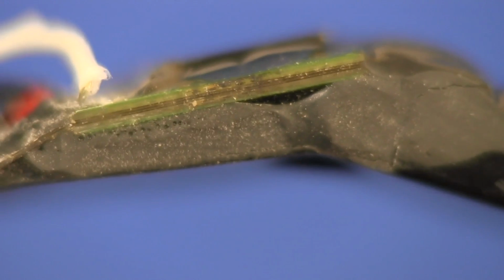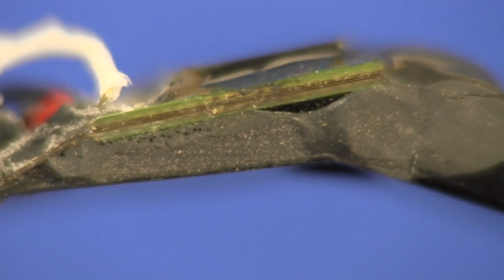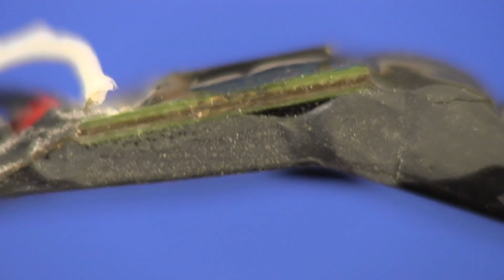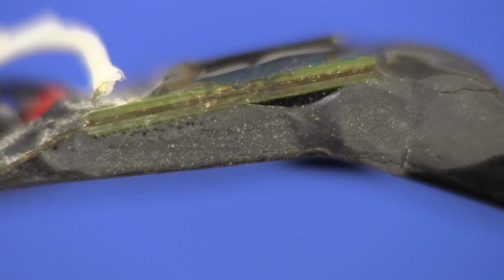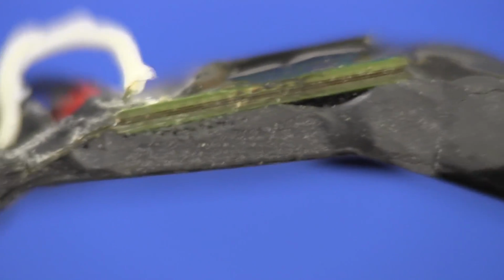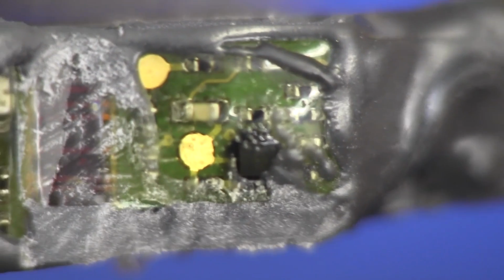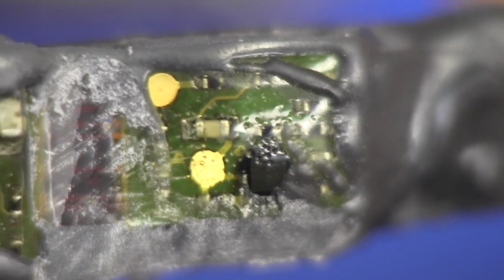It's a very common technique when you need to put something around a circular enclosure like this. I've done this before on seismic products, where circuit boards have to be wrapped around a central core in the middle, like a central wire bundle, and the PCBs have to wrap all around that. And you do that, join the boards together using a sandwich flex technique. And they've got some more circuitry on another board in there, and that looks like it's got a conformal coating on top of that as well, and then it's surrounded by the rubber.